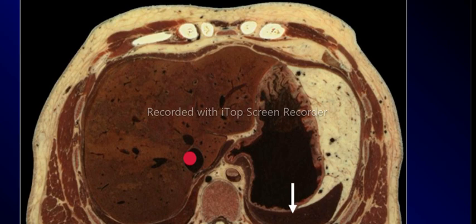Then this is your stomach, mesenteric fat, muscles of the anterior abdominal wall, and a few bones there that make up the sternal cage, the anterior ribs, muscles of the back. This is your spine, the vertebral body there, spinal canal, transverse process, spinous process, and then you have subcutaneous fat and skin on the outside.